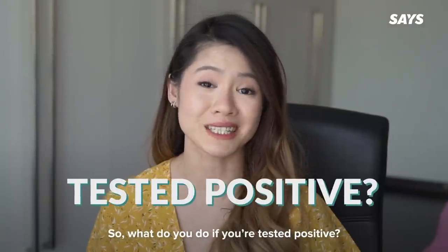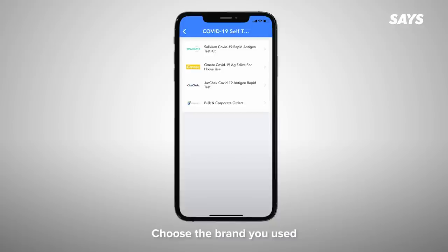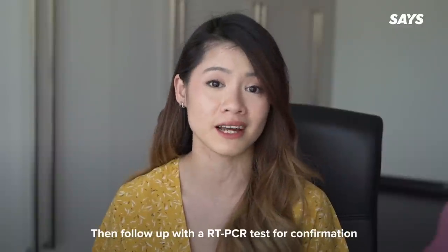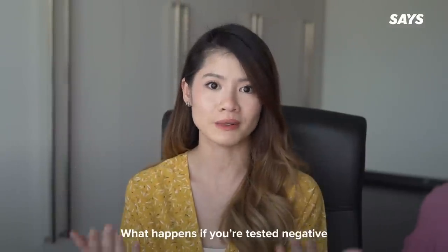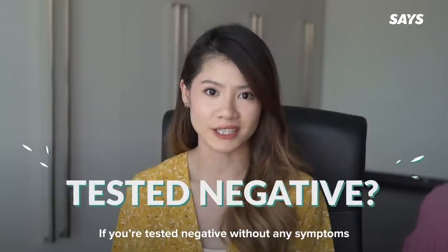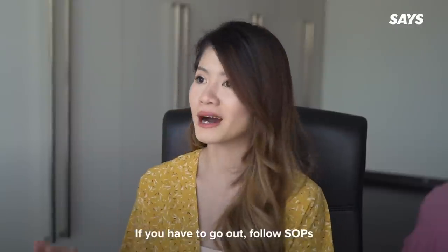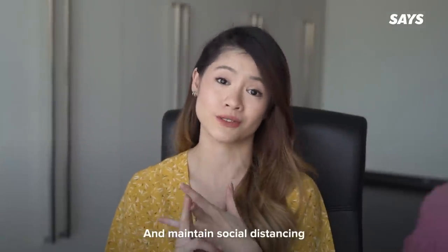Whatever your results may be, you must report it on the MySyJetra app. Just click on the COVID-19 self-test button, choose the brand you used and fill in your details. Then follow up with a RT-PCR test for confirmation and to eliminate any false positives. If you're tested negative but develop symptoms later, go get checked and do a RT-PCR test immediately. If you're tested negative without any symptoms, stay home as much as you can. If you have to go out, follow SOPs, double mask, wash your hands frequently and maintain social distancing.